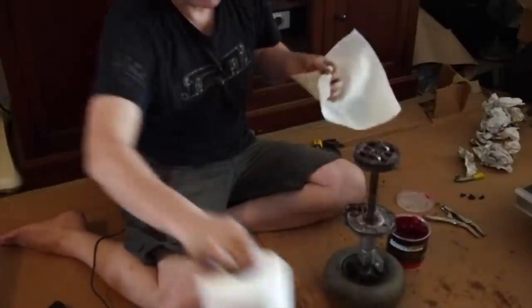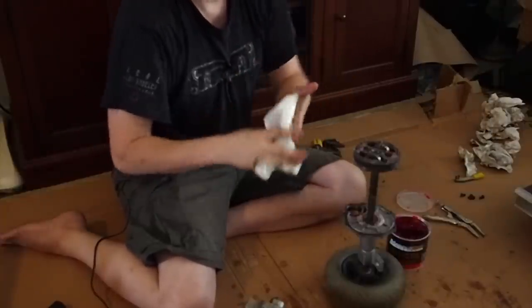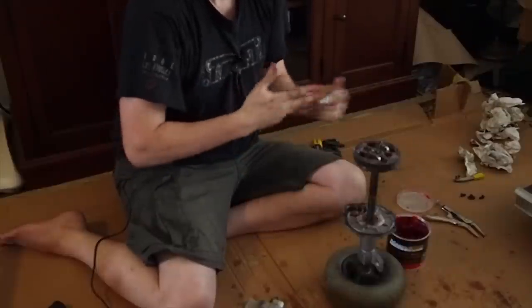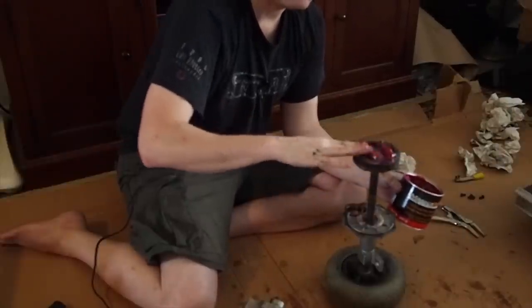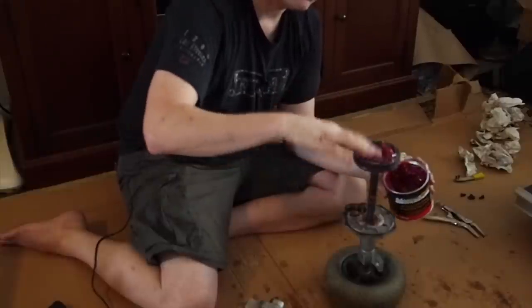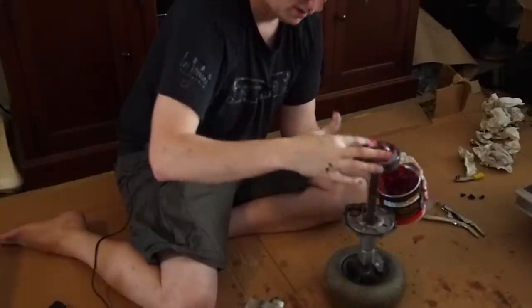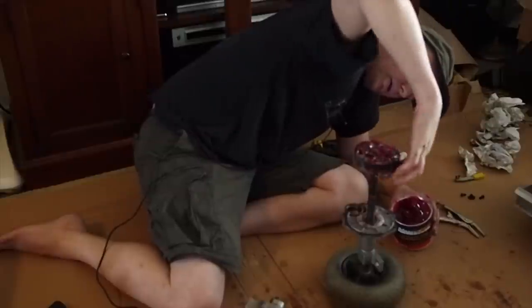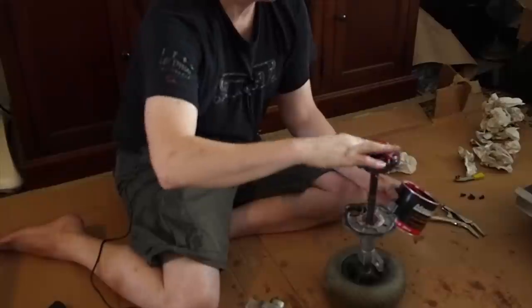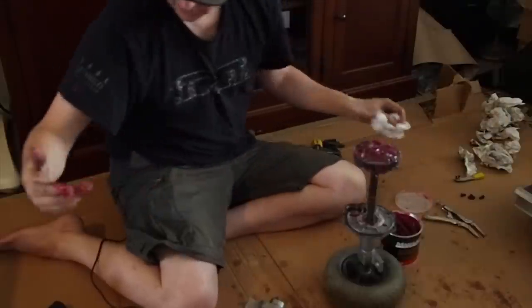I'm going to clean off my fingers a little bit before adding grease. I do have some dirt on them in the nature of handling the metal. I'm just going to pack this grease right up on top of here, get it in the holes. It's a messy job, it just doesn't matter. Just get it all over the gears, all the holes. Okay. That should be good enough.